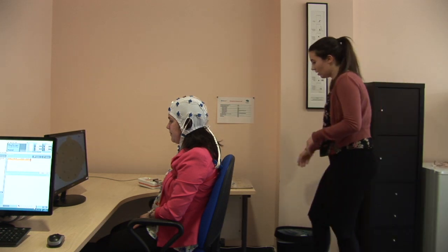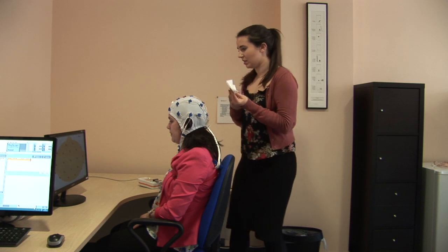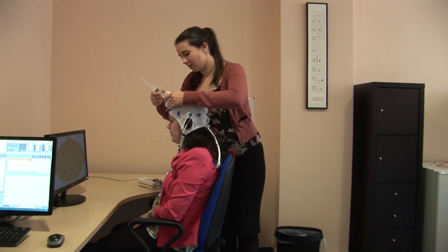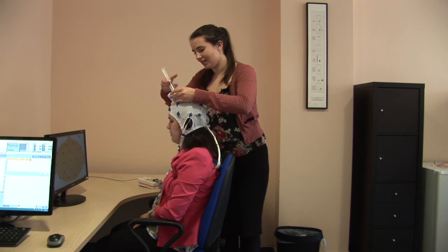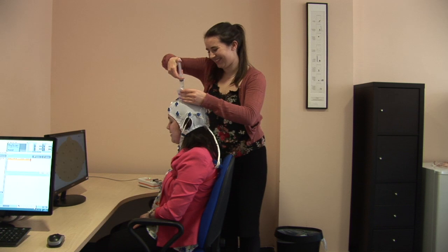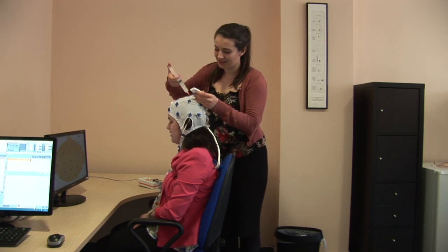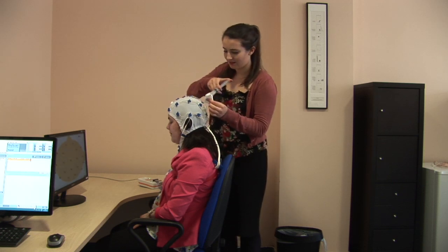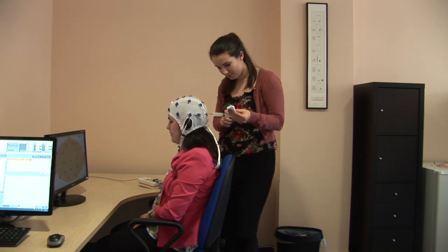In order for us to get a good signal, we need to help these electrodes to be able to measure what's happening in your brain by just popping in a little bit of EEG electrode gel, and that gel bridges the gap between your scalp and the little electrode, so that that electrical activation that's occurring in your brain can travel onto the electrode and be recorded easily. This is a standard practice. It's completely painless. All that will happen is the gel will be popped into each of those little electrodes and it feels a little bit cold.